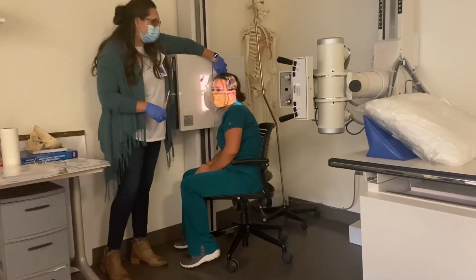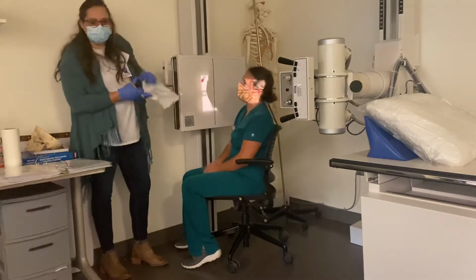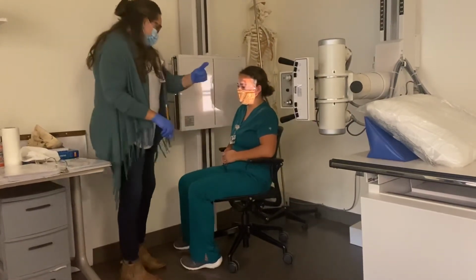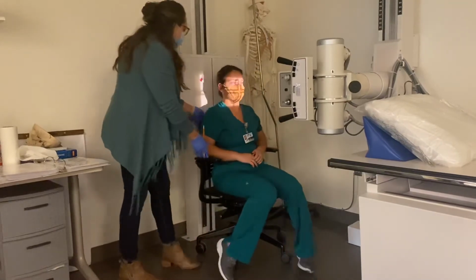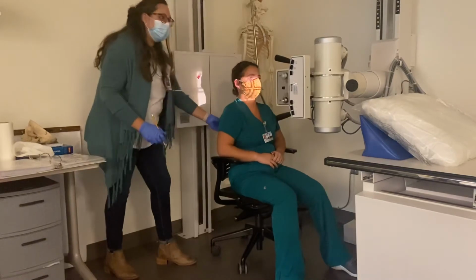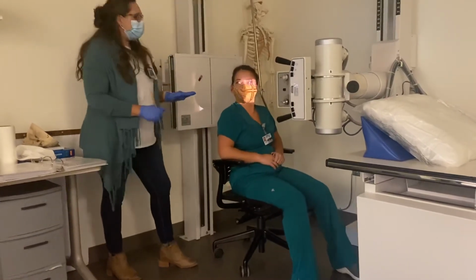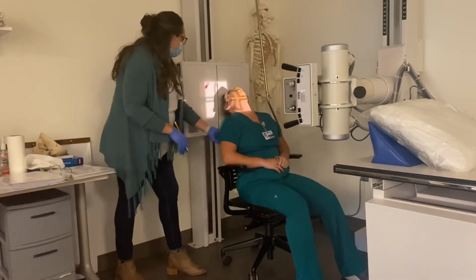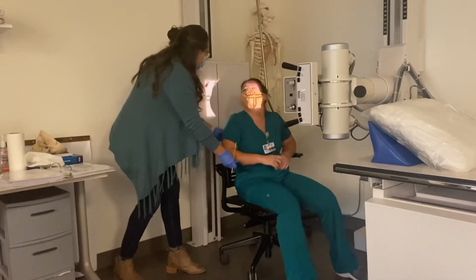The last view I do, I'm gonna take this, is the SMV, and I do this last because it's the most uncomfortable for the patient. So go ahead and turn and face out into the room. You wanna bring your patient about 12 inches away from the IR so that they have space to tilt back. And what you wanna do is tell your patient, I want you to lean back till the top of your head is touching this board. Oh no. Yeah, I'm gonna push it back a little bit more.